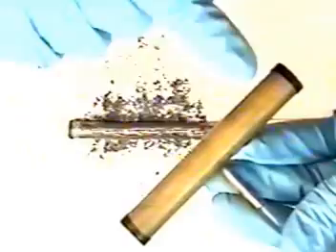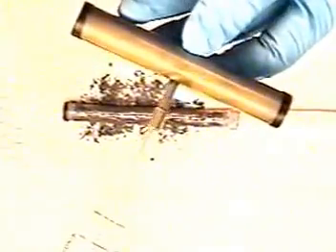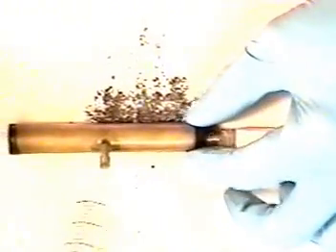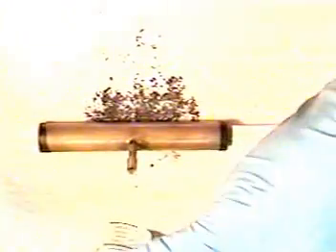With the bending rubber inserted into the vacuum jig, attach a syringe to the vacuum jig via tubing. This will apply the vacuum necessary to pull the bending rubber into the vacuum tube. Carefully slide the pressurized vacuum tube with bending rubber over and up until the insertion tube joint.